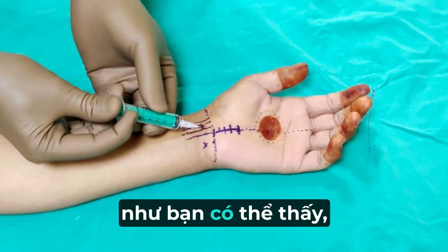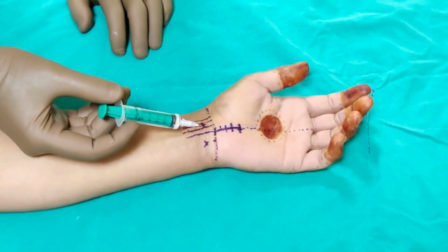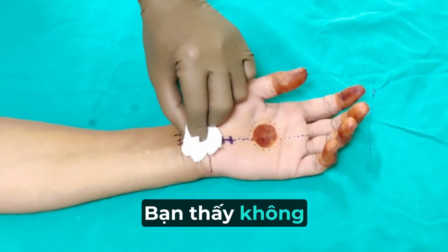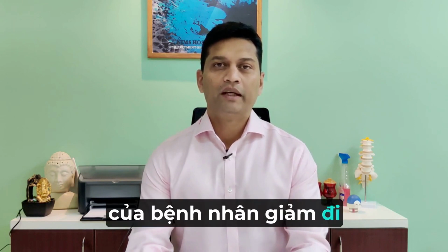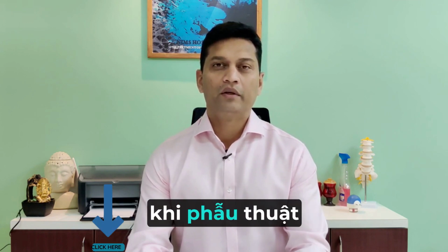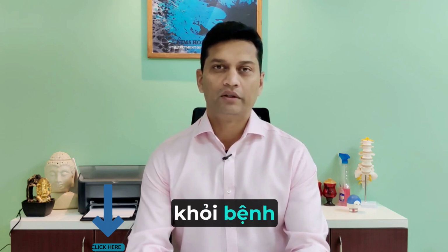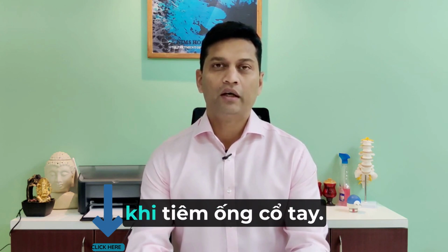So as you can see, the patient has got some pain, but it's not a very painful procedure. So this is our injection done, and this is how you inject a carpal tunnel. So this was a demonstration on how to inject carpal tunnel with a combination of lignocaine and steroid. If your symptoms get better, even if it comes back, it is usually a good prognostic tool. Patients who have got their symptoms better with steroid do very well after the surgery. I hope after watching this video, you feel confident in injecting a carpal tunnel.